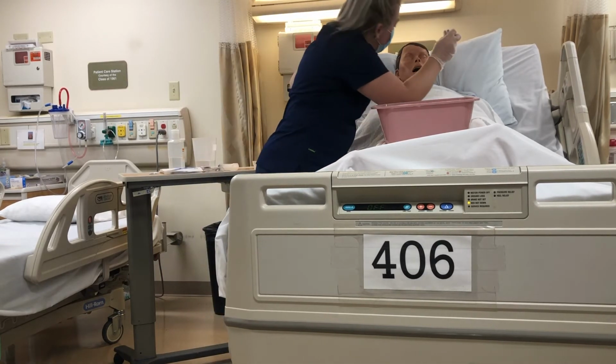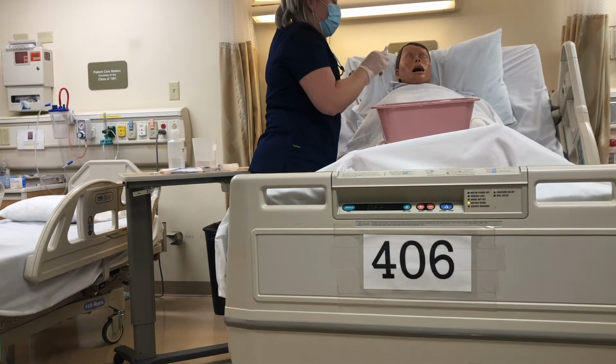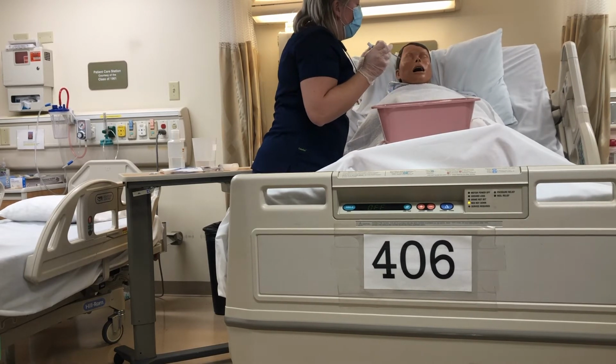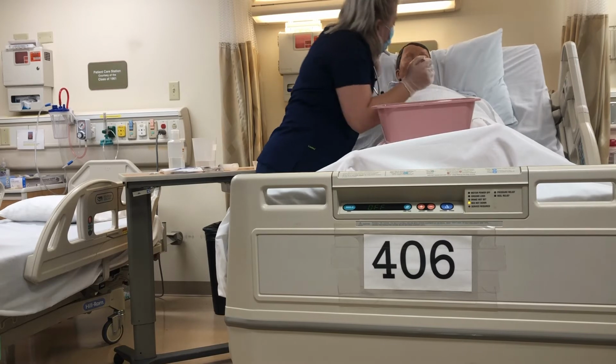Alright, so I'm going to look in your nose. Alrighty. And I'm going to check your gag reflex, okay? So you let me know when you feel like you're going to gag. Oh, right there? Okay.